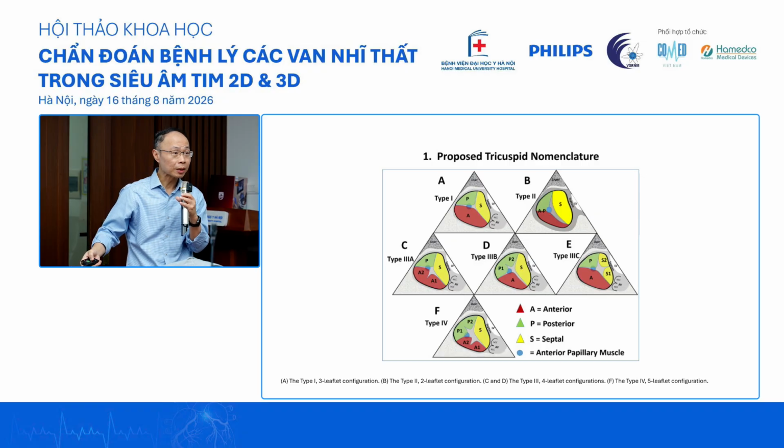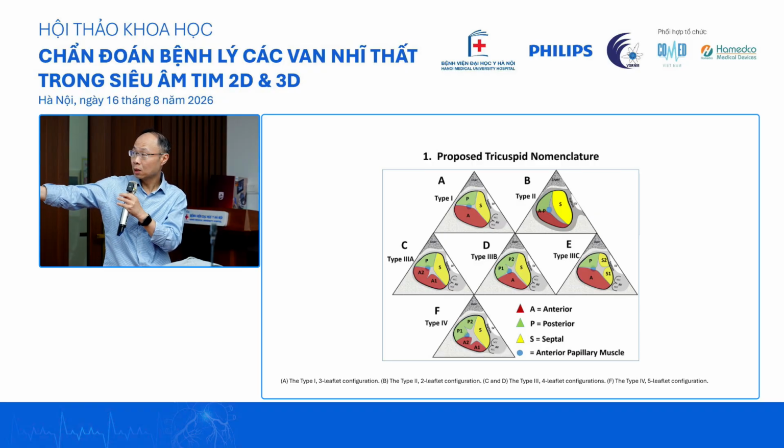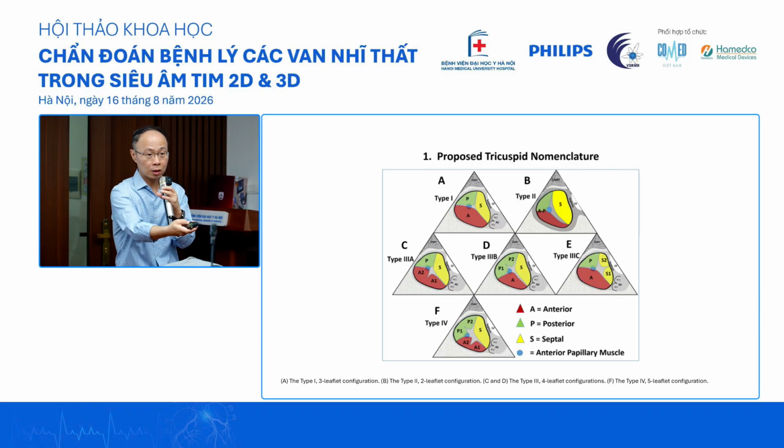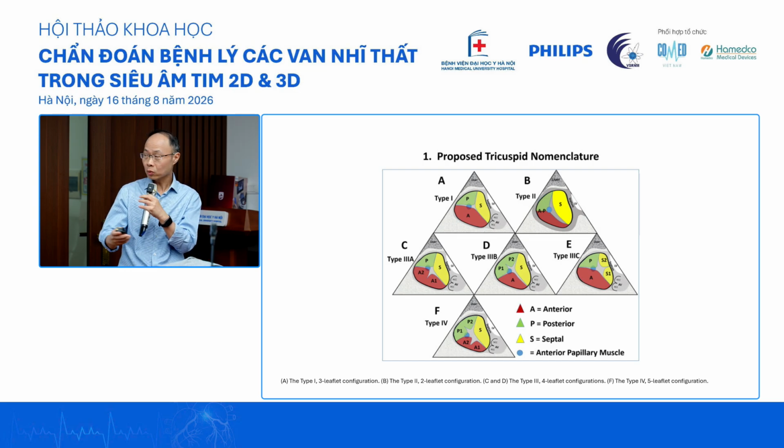In the end, it probably doesn't matter, because what we know is that any big gap, well, hopefully not too big, between your septal and this one, this is where our tricuspid clip, which Professor Kong will later share with you, gives us the best chance of success. If the patient needs to go for surgical correction, it doesn't quite matter, right? And if the patient is not a candidate for clip, again, it doesn't quite matter. Although what we do is go through the cases with our senior residents and our fellows, and engage in a very academic discussion as to what is what.